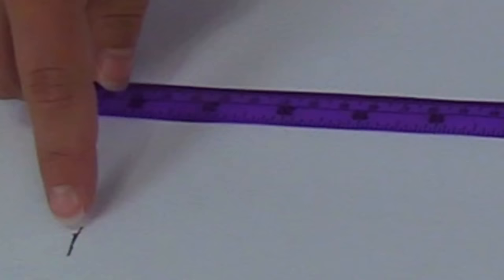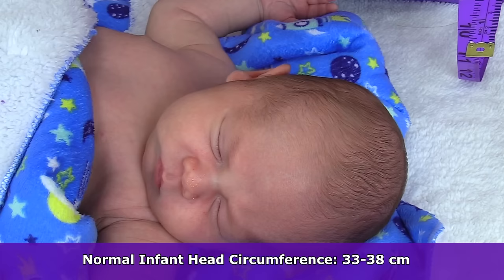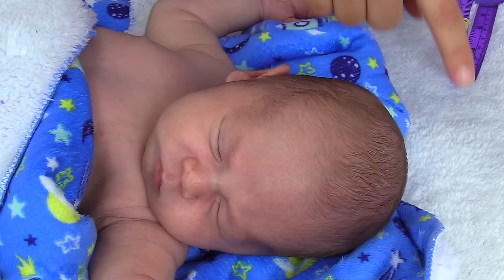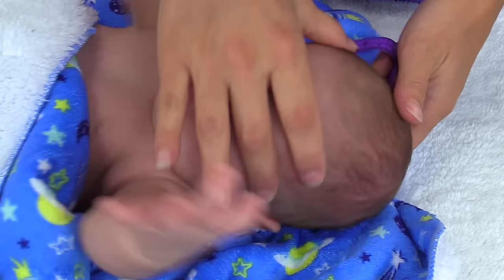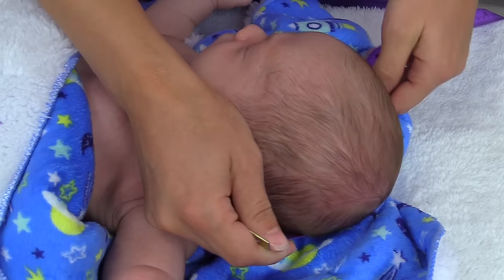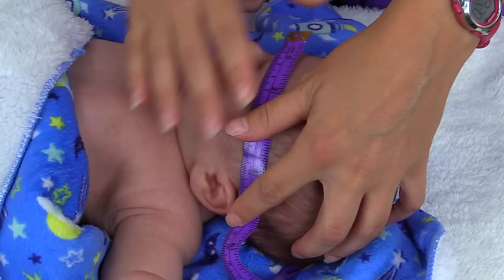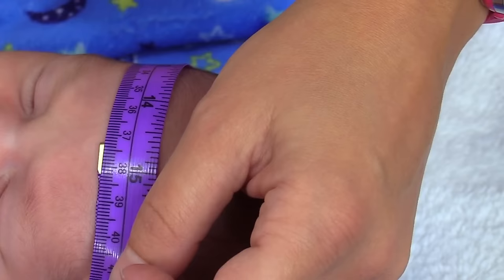To measure head circumference, you'll need a measuring tape that measures in centimeters. A normal head circumference in an infant is about 33 to 38 centimeters. You want to place the tape measure around the largest diameter of the head — place it a little bit above the eyebrows and wrap it around to the most prominent part at the back of the head. Gently lift the head up, put the measuring tape behind it, and pull it around. His head circumference is about 37 centimeters.